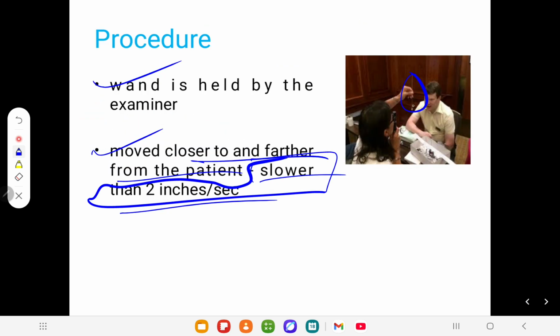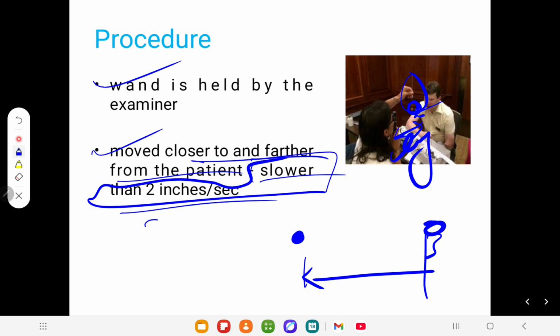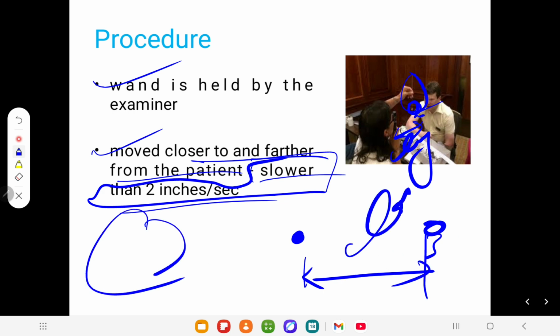In this case, this is the ball, and when the patient fixates the ball, we are actually behind the ball. That's why we discover a lag. That's the target, and that's where our retinoscope is. Then the distance here is to the patient's eye. So the distance is always a lag. So Bell retinoscopy is always lag.